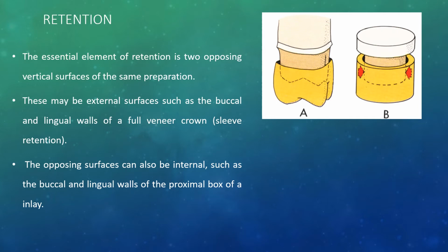The opposing internal walls must all be parallel.